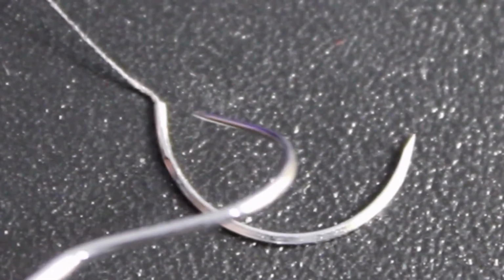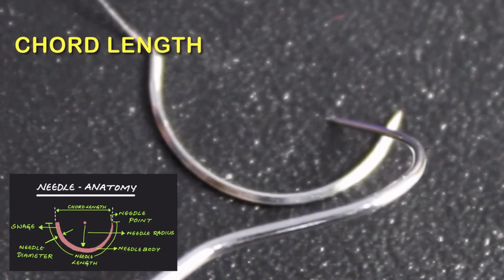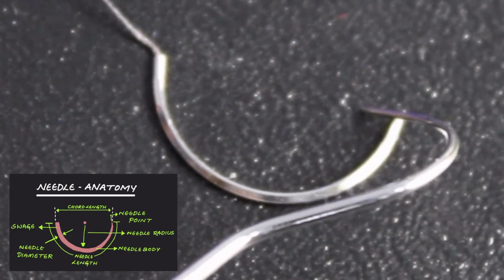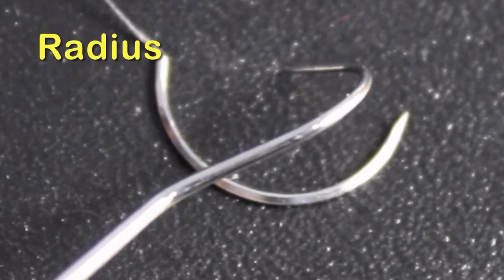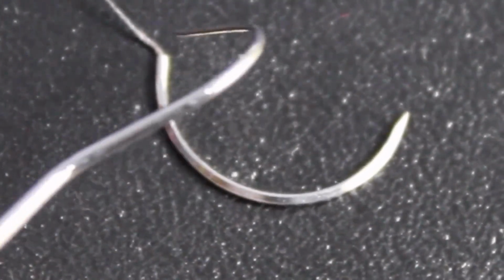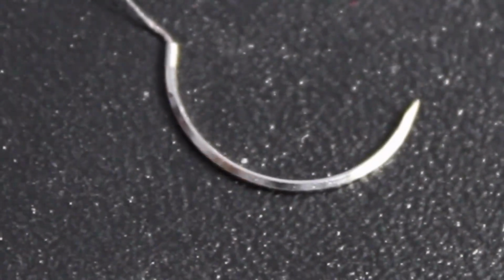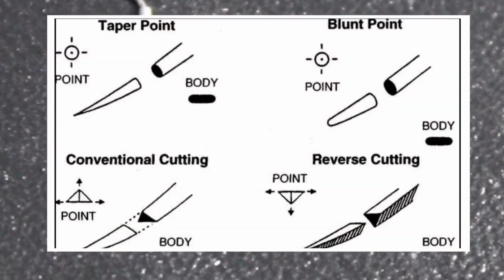Now, in addition to these three main parts, there are a couple of other important measurements you should know. First is the chord length. This is the straight line distance from the tip of the needle to the swage. And then there is the radius, which is the distance measured from the center of the circle to the body of the needle, assuming the curve of the needle were to continue into a full circle. This helps us understand the degree of curvature, which is important when navigating different surgical sites.